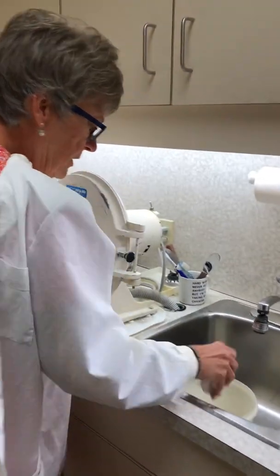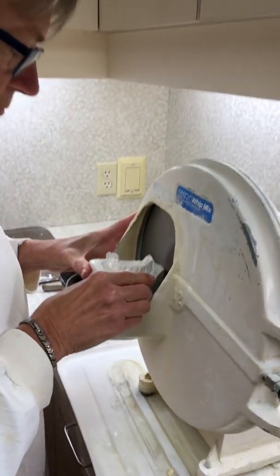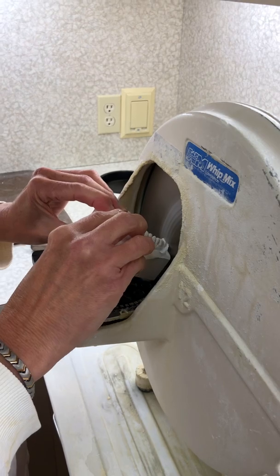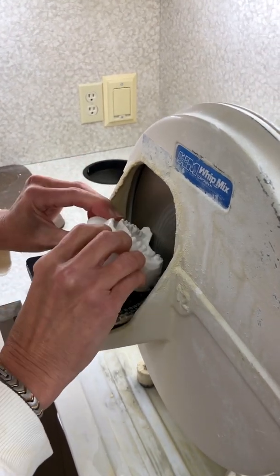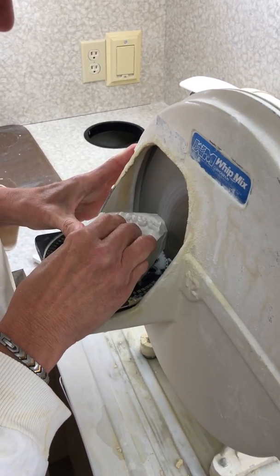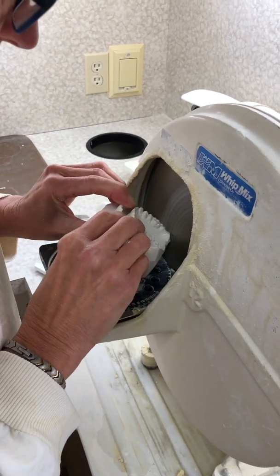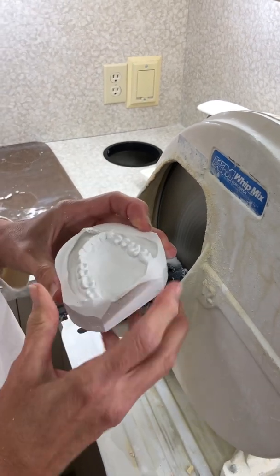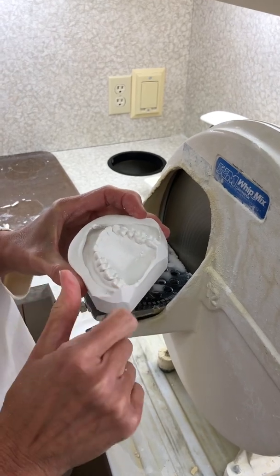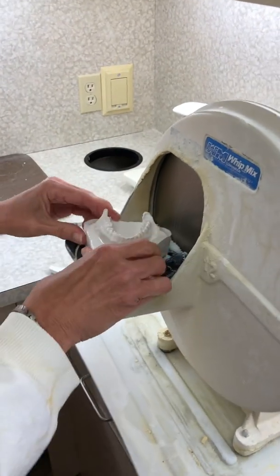So what I usually do with each model is I take off the back heel. I do that so that when we go to use our wax bite, that's not going to interfere with anything that's going on there. Okay, so we've done the top one, now let's do the bottom one.